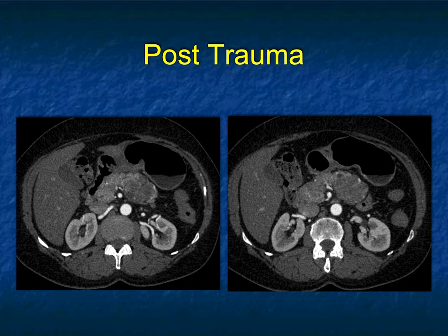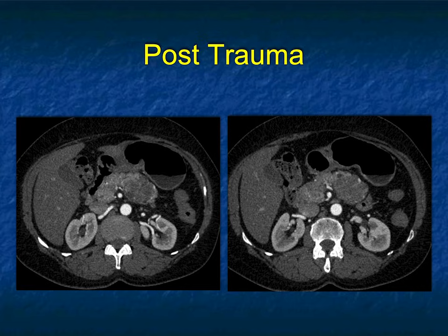This patient is post-trauma and you see a lesion in the tail of the pancreas — it looks kind of cystic. When I tell you trauma, you're worrying about pancreatic trauma. I don't see blood in the abdomen, I don't see any injury to the kidney, I don't see the spleen but maybe it's the sections. This looks cystic — with pancreatic trauma you get changes that look like pancreatitis or pancreatic lacerations.